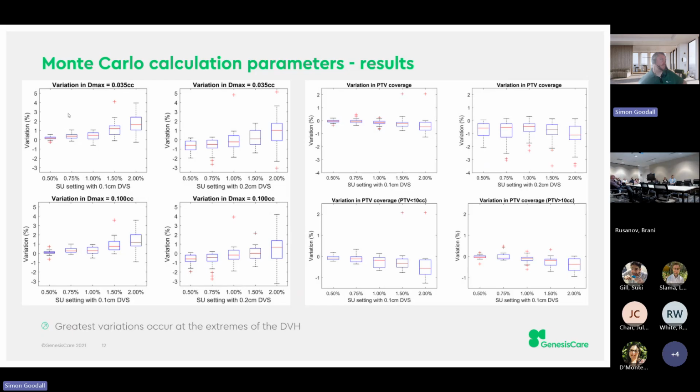And then when we look for the maximum dose, we inherently pick those values with the highest noise, which is what we're calling the maximum dose because they're maximum. So it's a kind of false reading, but artificially will project a higher maximum dose if we don't decrease the statistical uncertainty significantly enough.